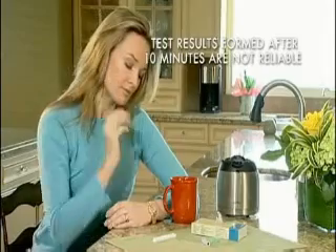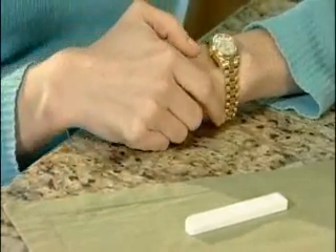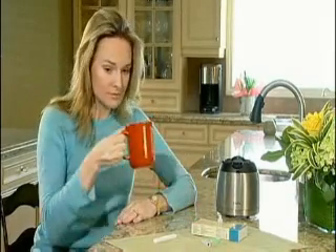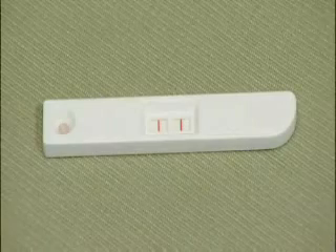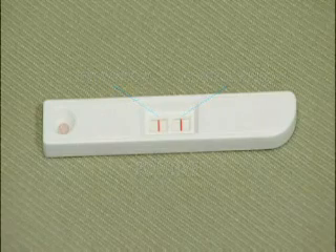The test result should be read after 5 minutes and before 10 minutes. A control line may appear first, but be sure to allow the BioCard test strip to fully develop for 5 minutes for an accurate result. The BioCard test result is positive for celiac disease if a red line appears in both the test window and the control window.